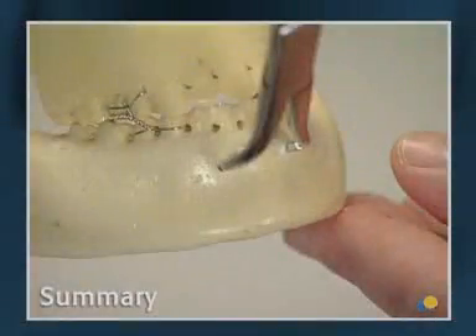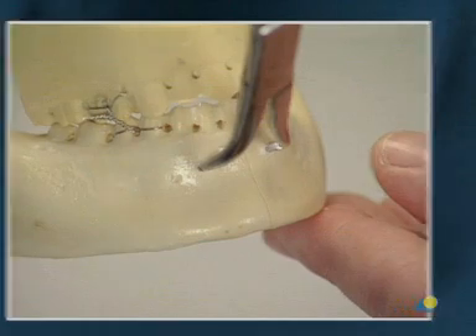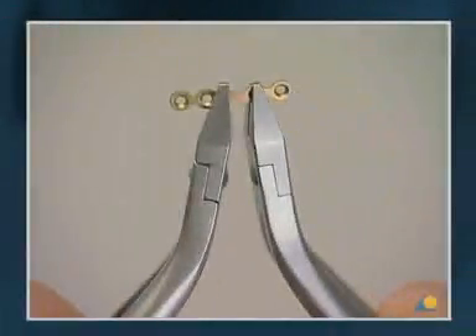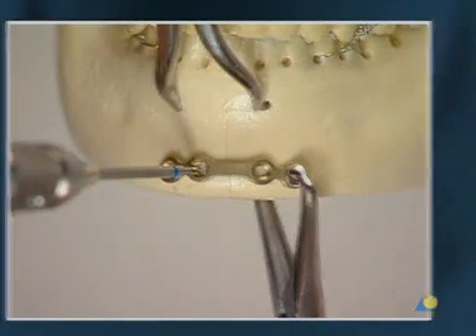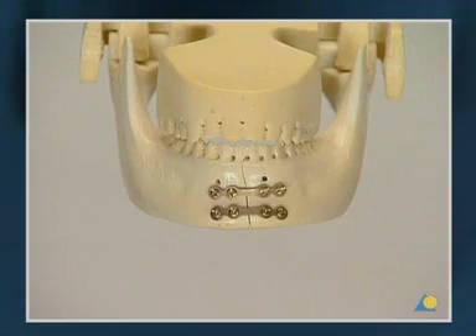This exercise has shown the importance of correct occlusion and anatomical reduction to reproduce the original shape of the mandible before the fracture is fixed, and the correct technique for applying the two 2.0 mandible mini-plates. With this method, fixation is stable and technically easy, but it is not as stable as lag screws and compression plating.